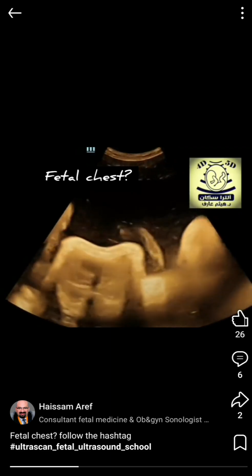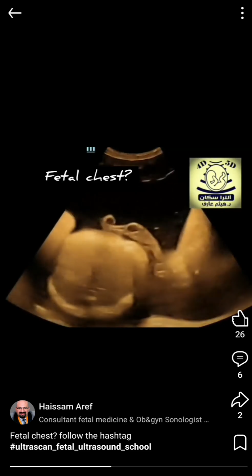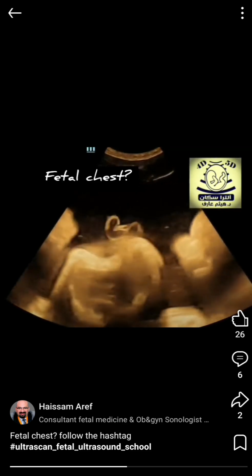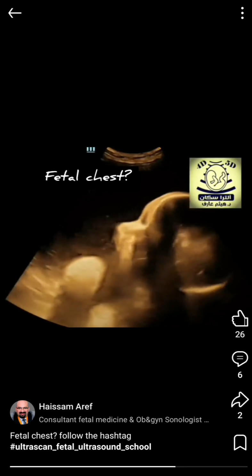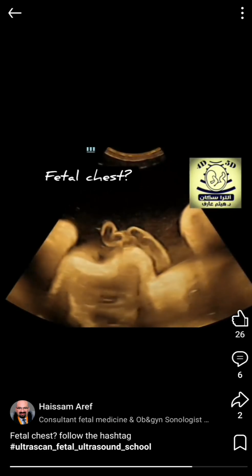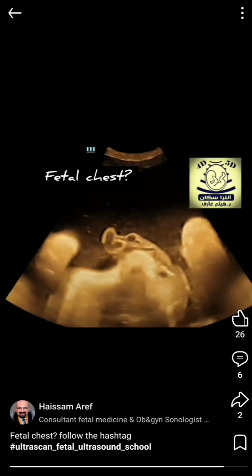It's very much a case of pectus excavatum, and you can see the appearance of the fetal chest. So apparent. It is also associated with polyhydramnios, and surely there is a single umbilical artery.